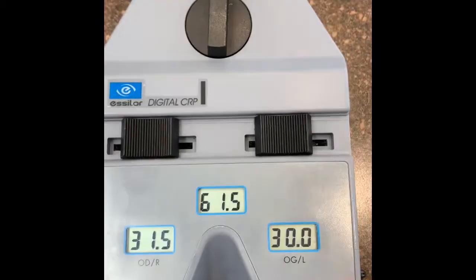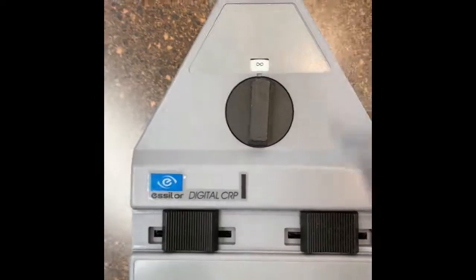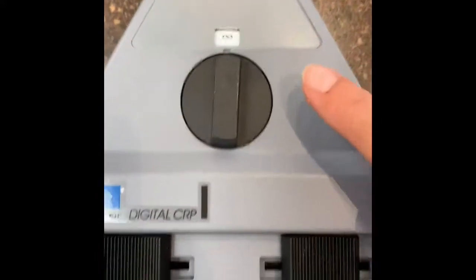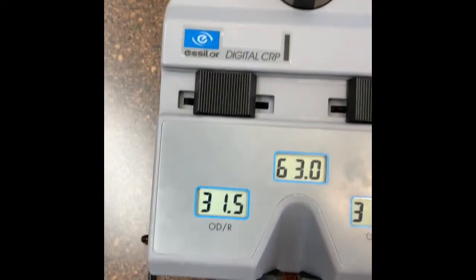When it's on, you will start to see measures. These control how you line up this little bar that's on the viewfinder. And then this part goes to the nose. We're going to set it to distance, which is infinity, and then we're going to place it on the patient.